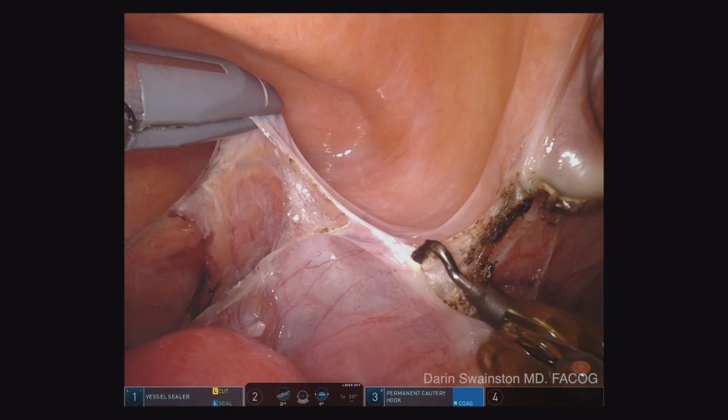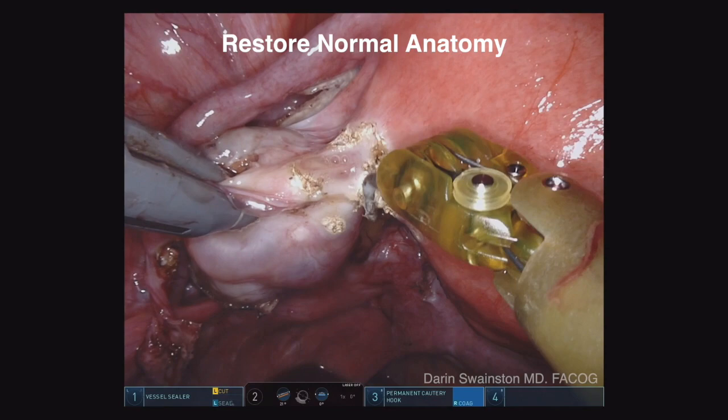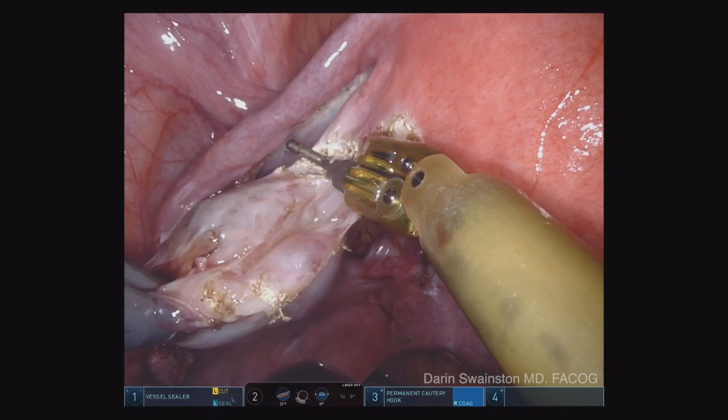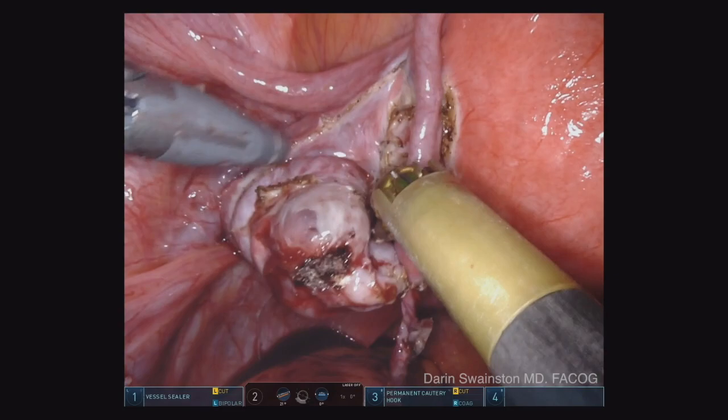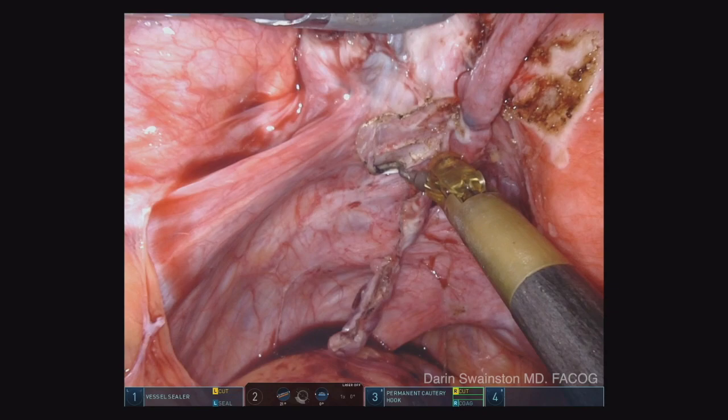This is a really useful trick when you have a large uterus — sometimes the round ligaments hold the uterus deep in the pelvis. Another thing you want to do is reestablish normal anatomy. I'm using the monopolar hook and dissecting the scar tissue of this ovary against the uterus first before taking the uterine ovarian ligament, because when you reestablish normal anatomy, you get into less trouble. I'm going to release some of that scar tissue up against the ovary to decrease the chances of that ureter being too close.